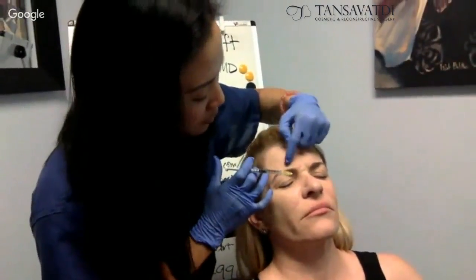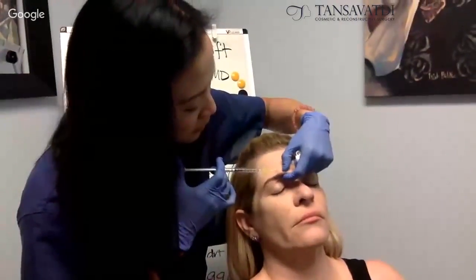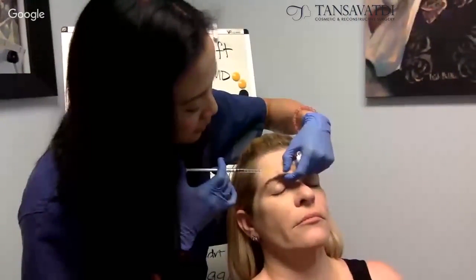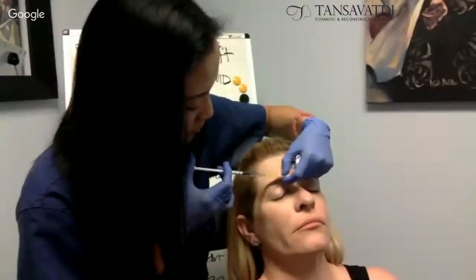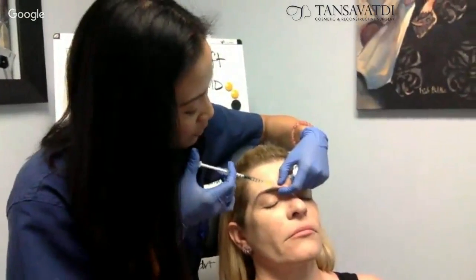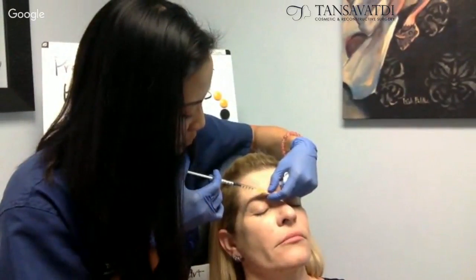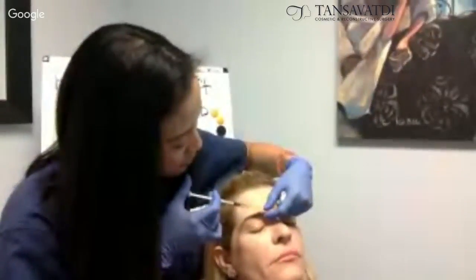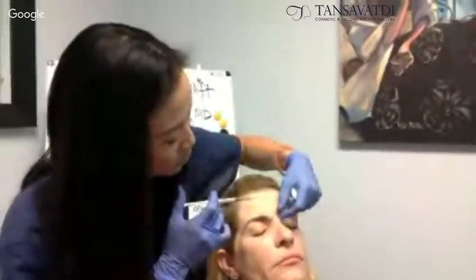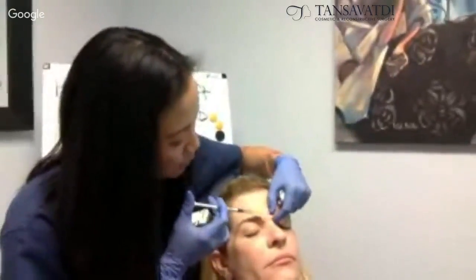Right here is very strong, this whole area. I'm going to grab the muscle — relax now — and I'm going to inject. First injection is here, and then another injection here. I'm injecting very close to the brow, because that's where the muscle is right underneath that brow.